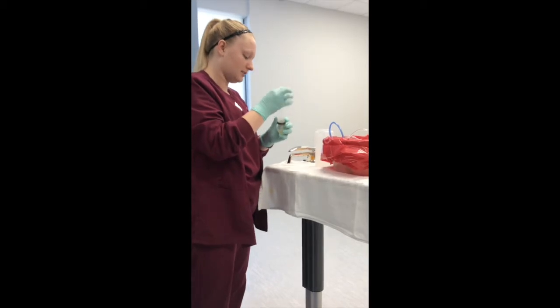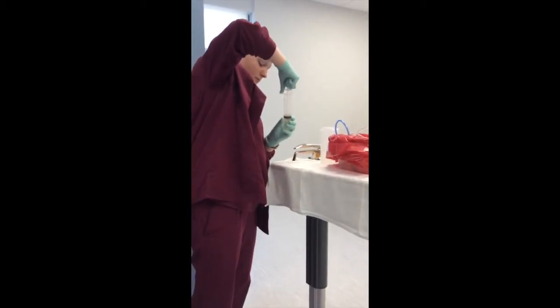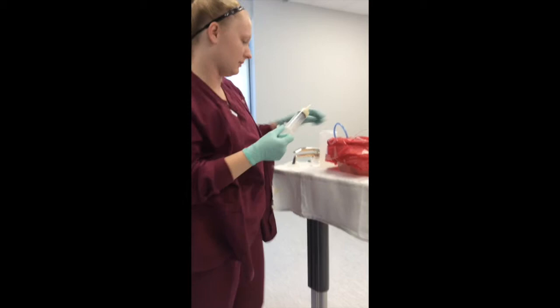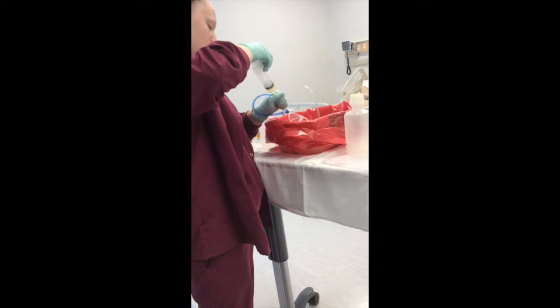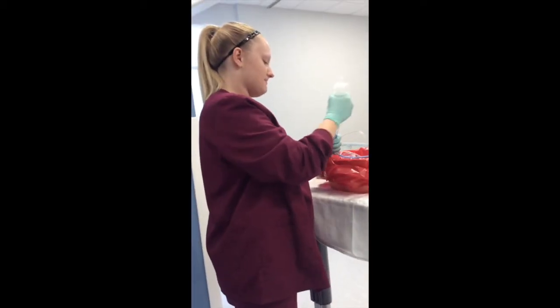I'm going to go ahead and draw it up with my syringe. And I'm going to go ahead and unclamp, and I'm going to go ahead and administer it. I'm going to reclamp it.